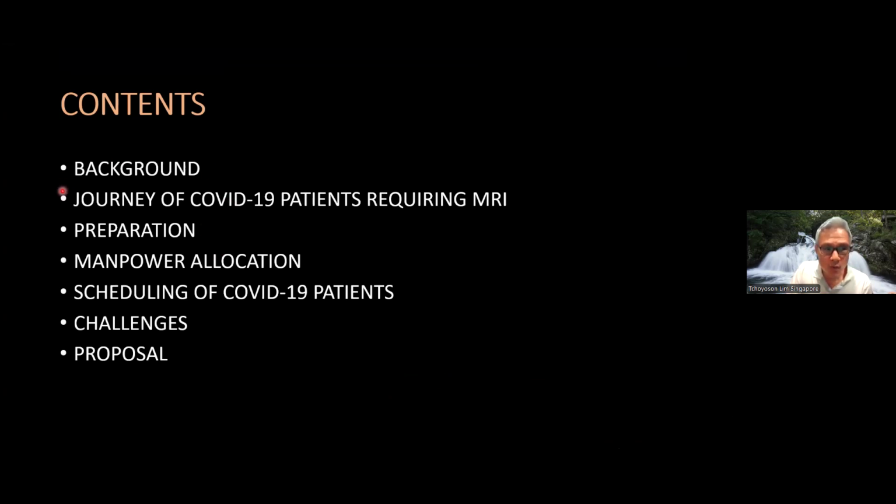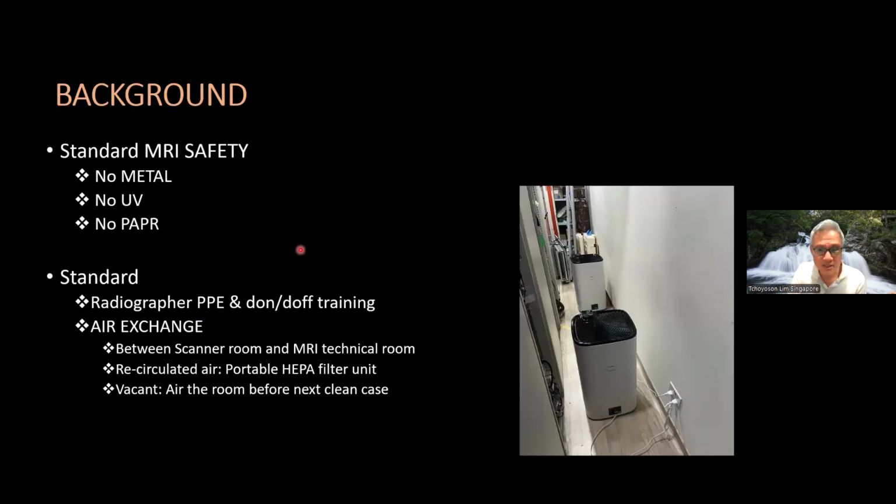So at the height of the pandemic in 2021, the journey of all COVID-19 positive patients who required an MR study, the steps in terms of extra manpower, scheduling, porterage, and the different challenges are going to be described in this talk.